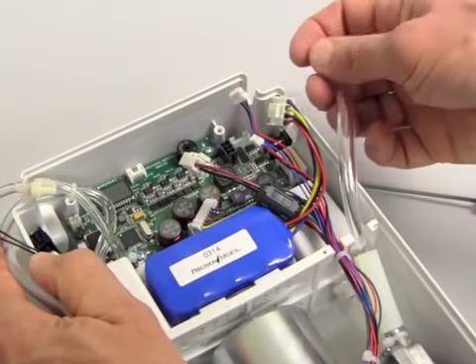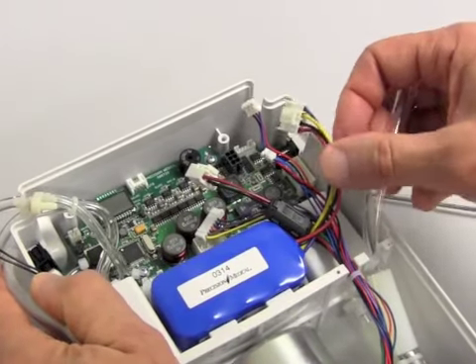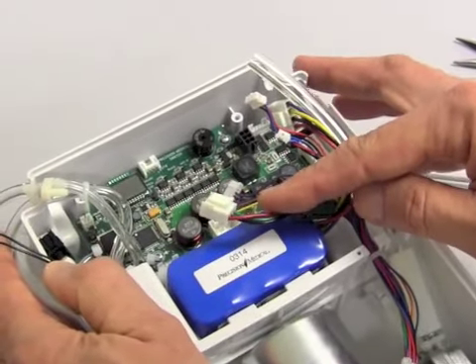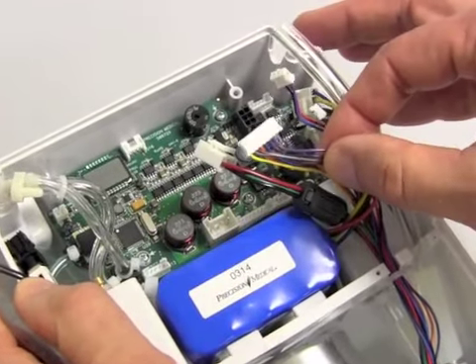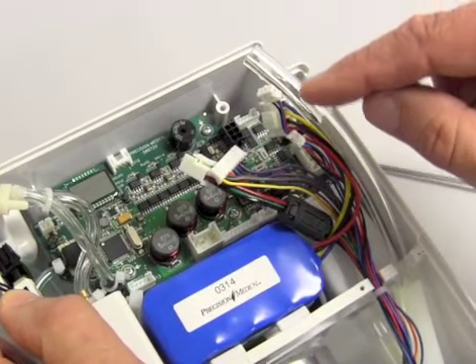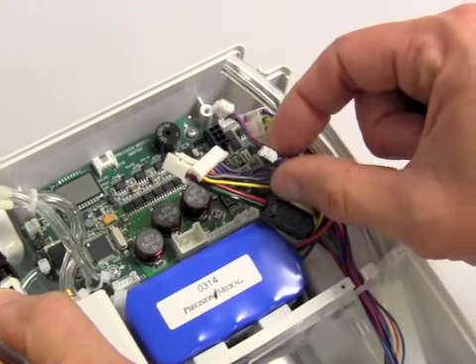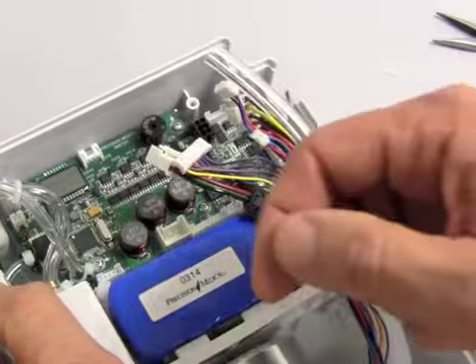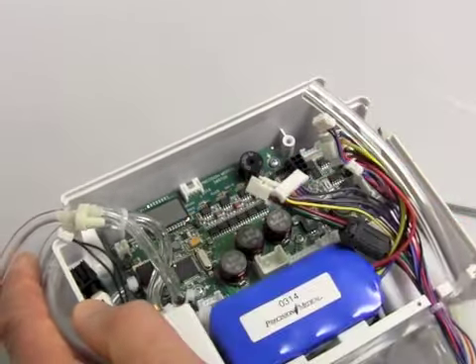Okay, the next step would be to plug all the components back into the circuit board. You have the power for the compressor that has to be plugged into the first jack, then the alarm compressor, and then the two power leads for the fans. And this is important to note that it doesn't matter which power socket these go for the fan, that they can go into either or, right? And the last thing, which we cannot forget, is the valve has to be plugged back into the circuit board.